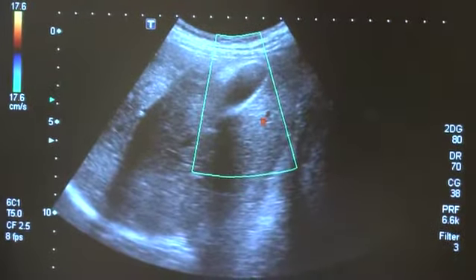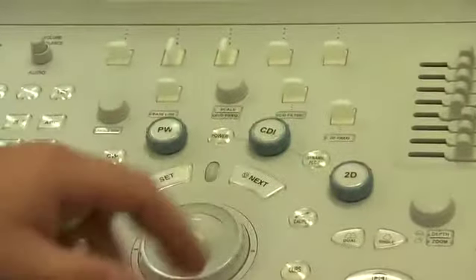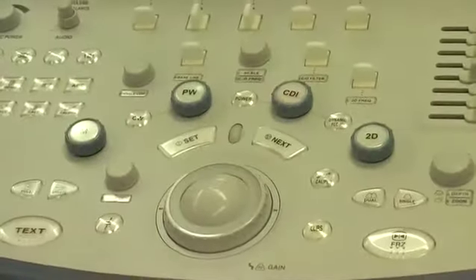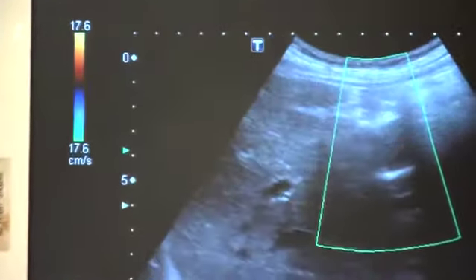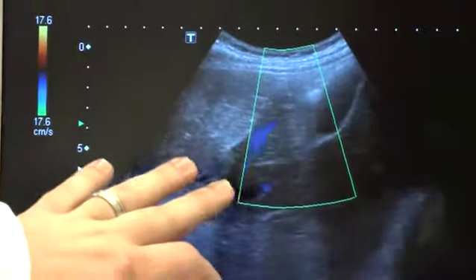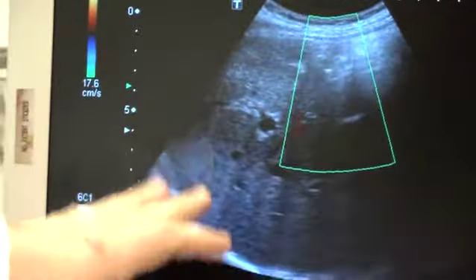Okay. So there are many forms of Doppler, but all Doppler does is tell if there is flow coming from a particular reflector. CDI stands for color Doppler imaging. That brings up some sort of color scale that can tell if there is flow, yes or no, and what direction that flow is going. Blue means the flow is going away from the probe.